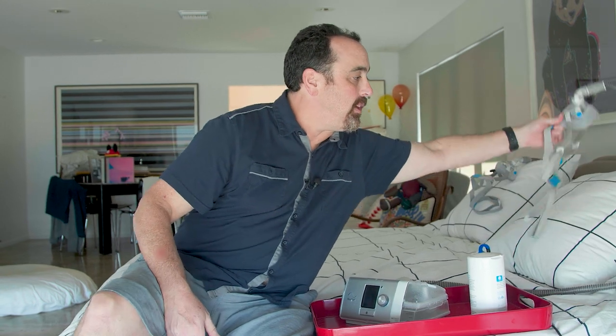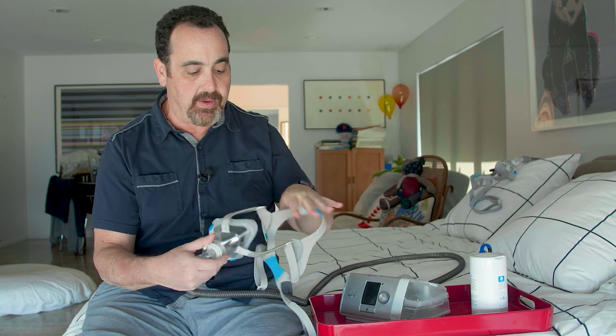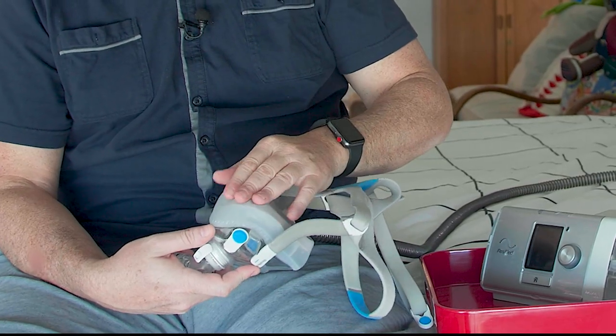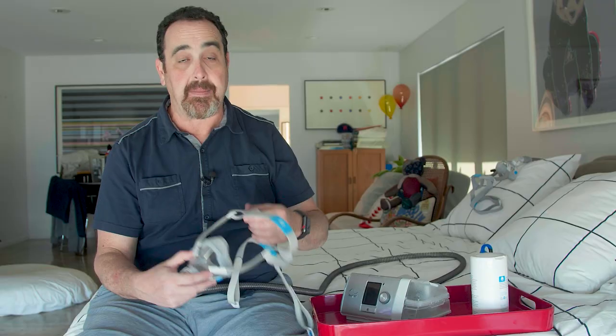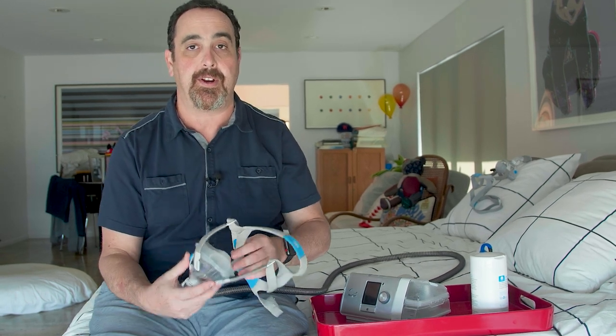I've been wearing this mask for almost 11 years. They've now innovated to where they have foam cushion liners on the mask — they actually last longer, they're softer, there's less irritation. I'm not trying to do an advertisement for a mask; I'm just telling you that the innovation is there, they're listening to patients and starting to figure it out.